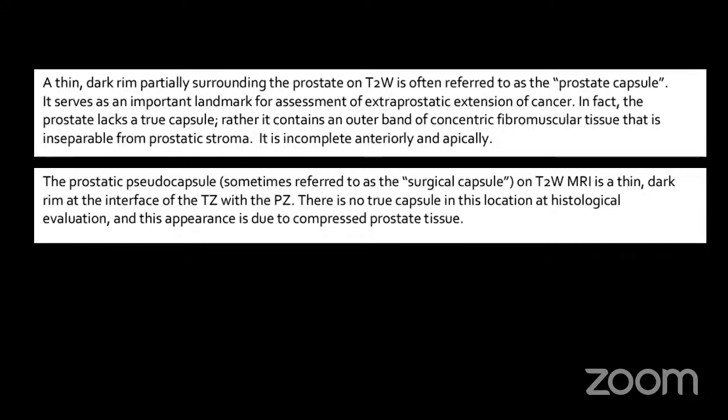So even the benign prostatic nodules, we see them bulging into the peripheral zone, and the neoplastic process, which is epicentered in the peripheral zone, getting entry into the transition zone.